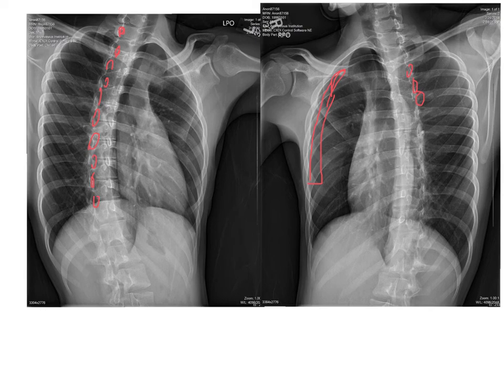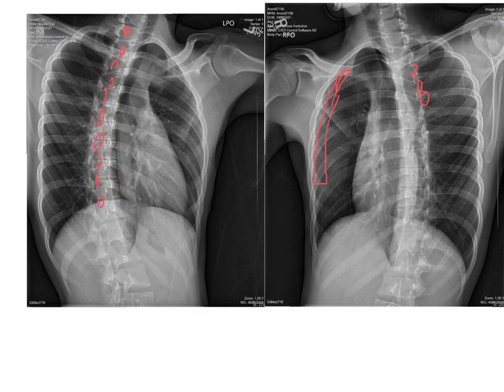I could not find any images for below diaphragm ribs. The only thing I could tell you to remember there is to make sure that you have ribs 8 through 12 included. You're taking these images on expiration, which pushes the diaphragm up, and you should be able to see ribs 8 through 12 through the diaphragm. That's going to give you a good indication of whether you have the technique or not, if you can follow the outline of those ribs through the diaphragm.